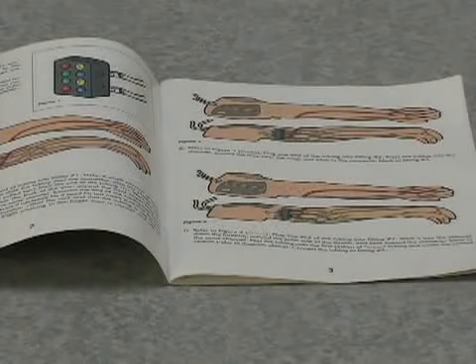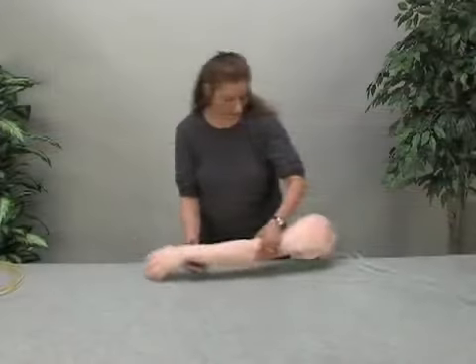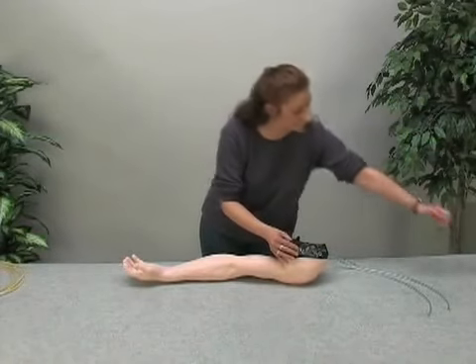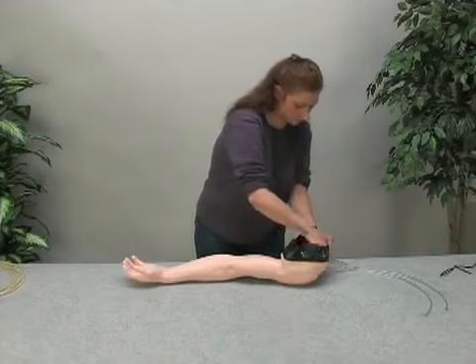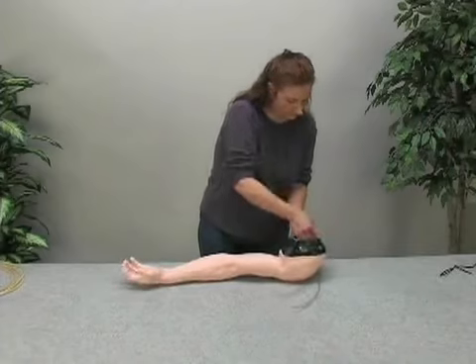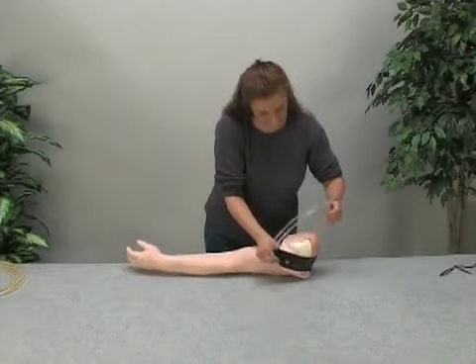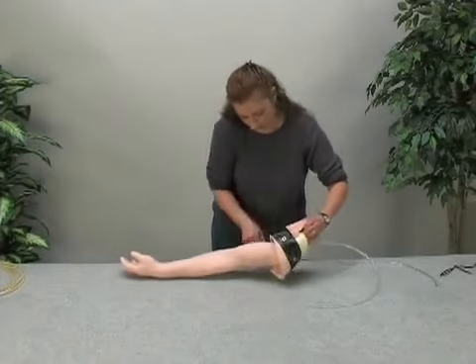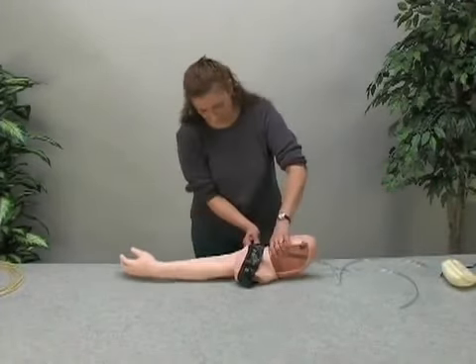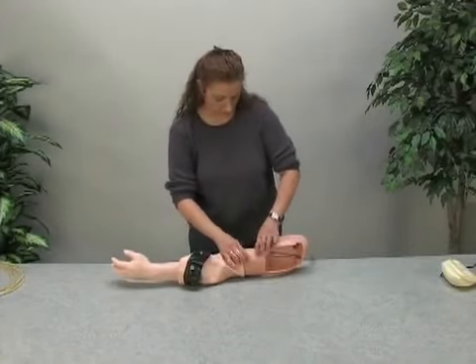The first step is removing the used skin and veins from your existing IV arm. Untie the string from around the shoulder opening. Take the 2 inlet-outlet tubes out of the arm skin and pull down the skin from the arm. Remove the foam shoulder pad. Remove bicep muscle.